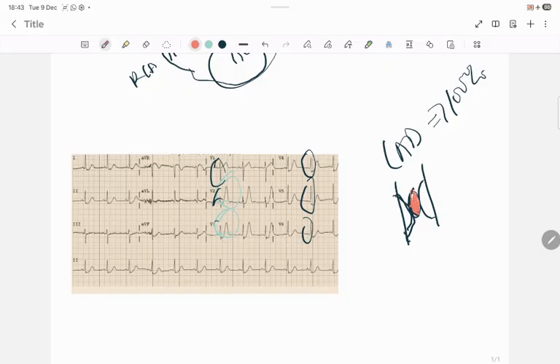And this is dangerous. When no blood is supplying the anterior part of the heart, that part of the heart cannot pump blood. What do you expect? Arrhythmias, ventricular fibrillation. This person is minutes away from death. So this patient needs the cath lab immediately. The same urgency as you will give a classic ST elevation is what you will give here.